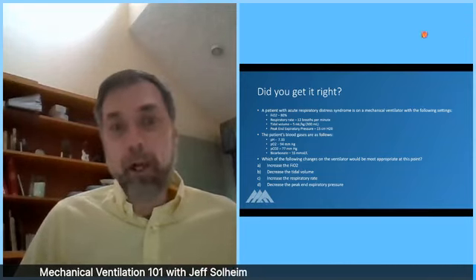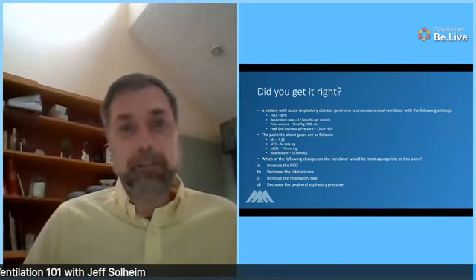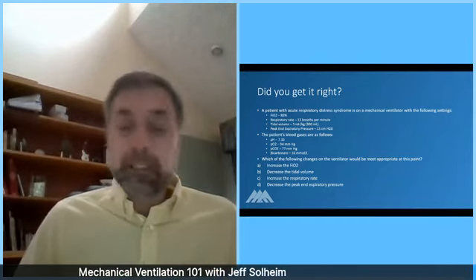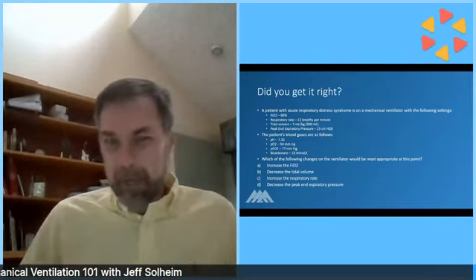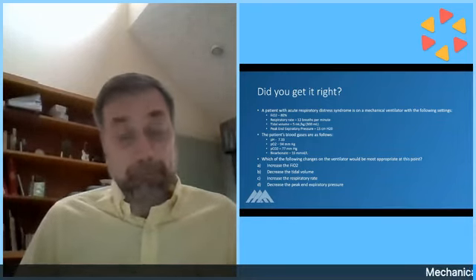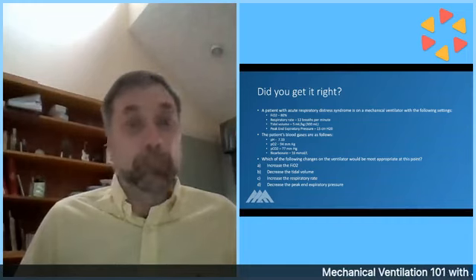Now, the blood gases you get back are pH of 7.33, which is close to normal, right? Just a little bit on the acidotic side, but that's not bad. A PO2 of 84, which is a little bit lower than I would like, but it's not bad. Certainly with an FiO2 of 80 and a PEEP of 15, I'd love to see that higher, but 84 is acceptable.